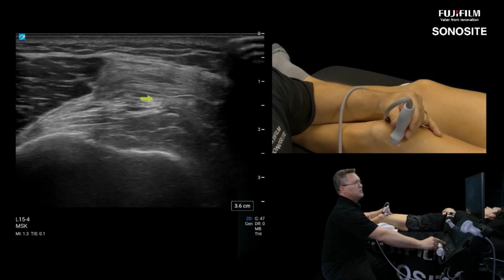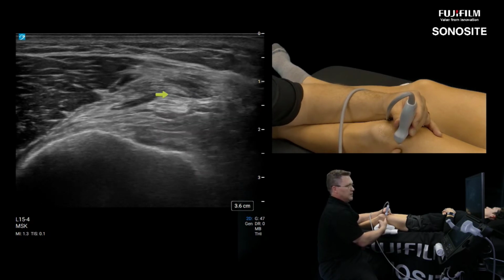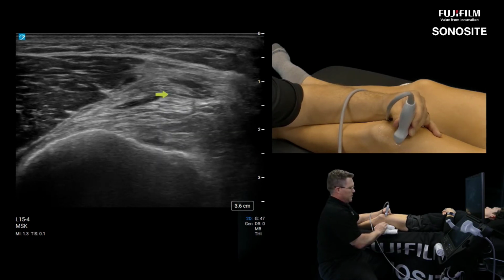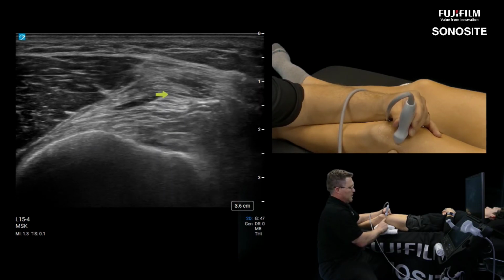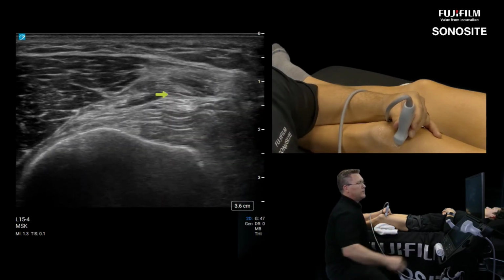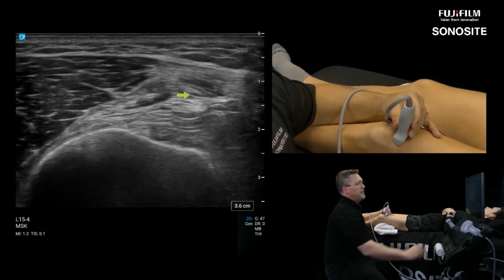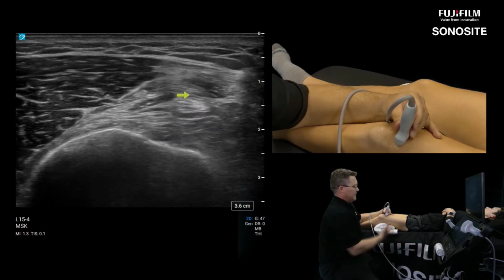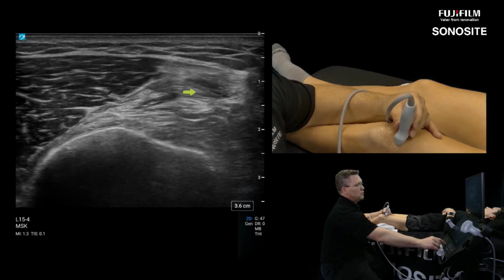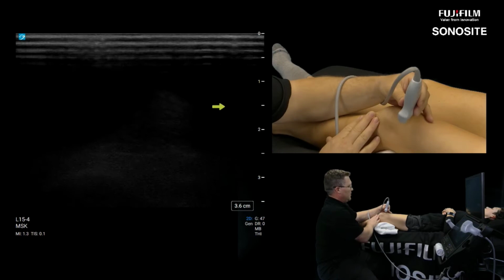So what you would want to do there is just drive your needle right under the quad laterally in this direction here. Drive your needle above the IT band right here. And then we're going to aim slightly towards the transducer. Okay. And then we're just going to drive the needle from lateral to medial and plop it right there under the quad. And then give a test injection. If the injection were to ball up and blister up around your needle, then you would be missing the knee joint.